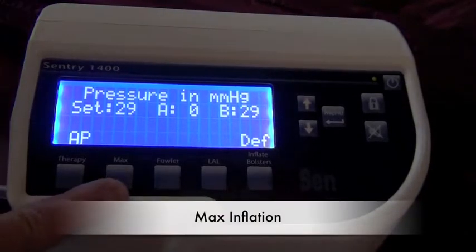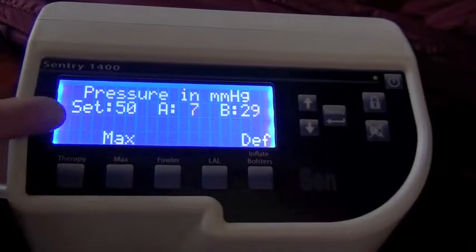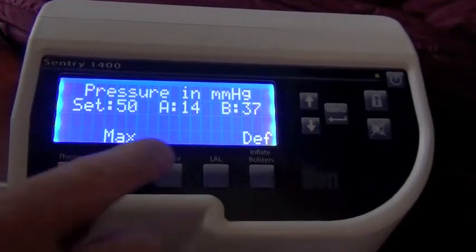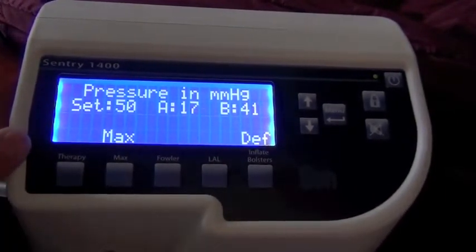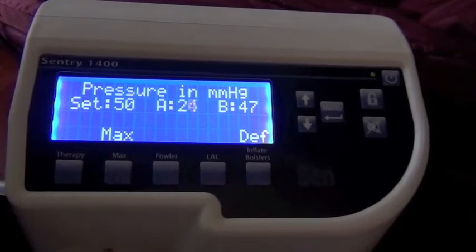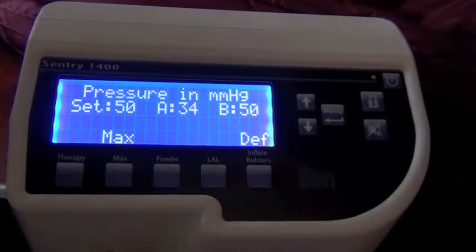Let's move down the ladder here. The next button is called Max. And when we push maximum inflate, the first thing you notice, our set pressure goes to 50. And what Max does is it makes the surface uniformly firm. A setting of 50 is firm. And the system is rated to 500 pounds. So a setting of 50 in the Max is going to provide a firm surface even for someone of that much weight. Max is typically used for repositioning the patient.